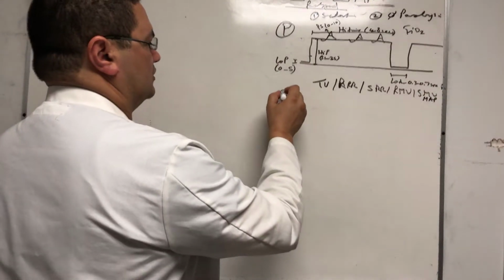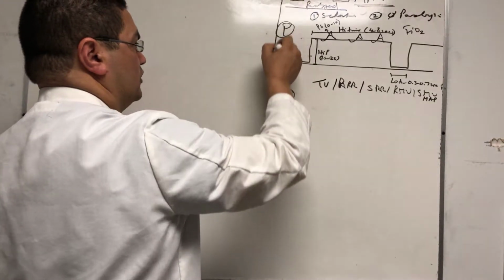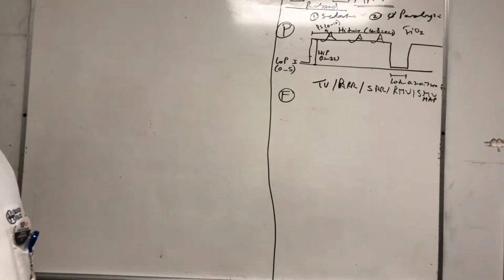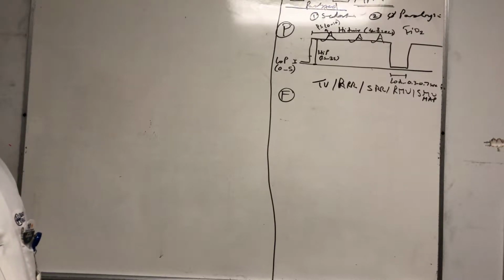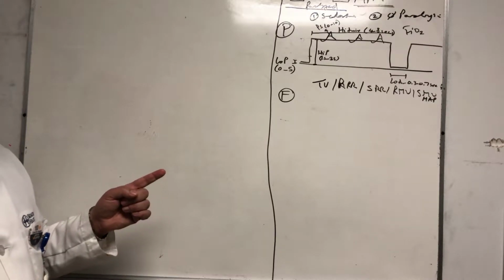Now, the next waveform is the flow waveform, right? These are the two that we usually look at when we go see the vent. This is the second waveform on your vent screen usually. And the flow waveform, if you're gonna forget everything about what we talked about today, if you decide to forget everything, don't forget this one. This is how you're gonna kill patients, right?